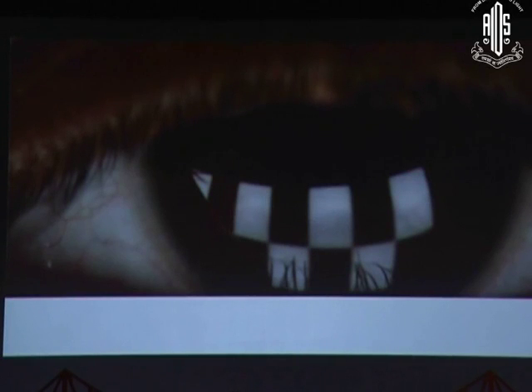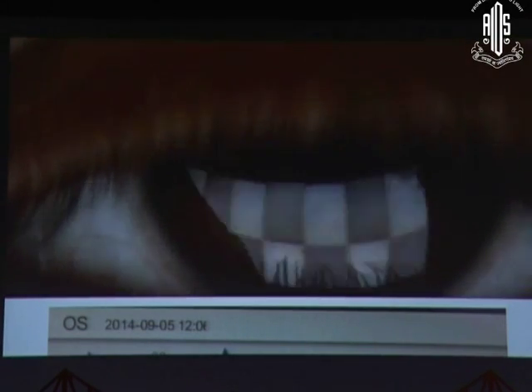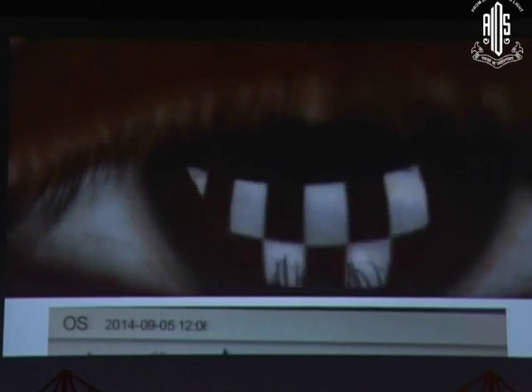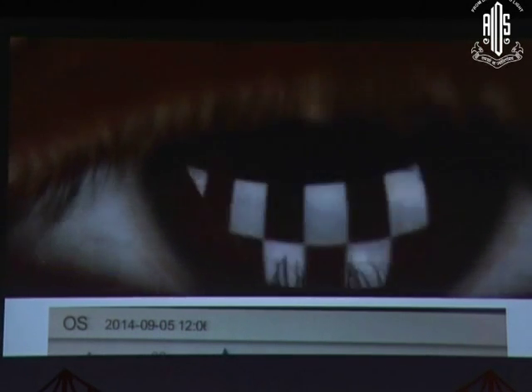What is most important in this LipiView is that it gives you the number of partial blinks that a person does. So it is not only the lipid layer which is important, it is also important that we see if the patient is blinking completely or not. The patient here is not blinking completely, and that is why even with the normal metrics, the TBUT was less, so was the patient experiencing the dry eye symptoms.